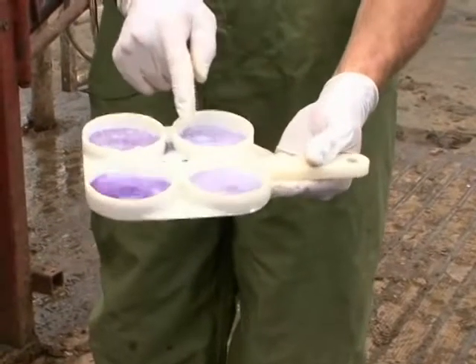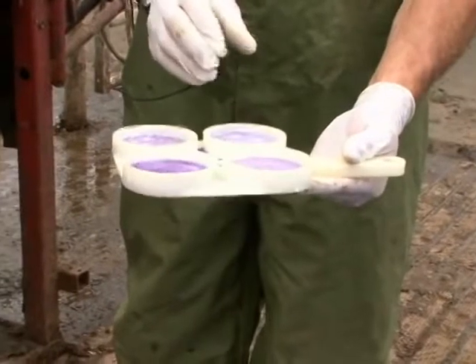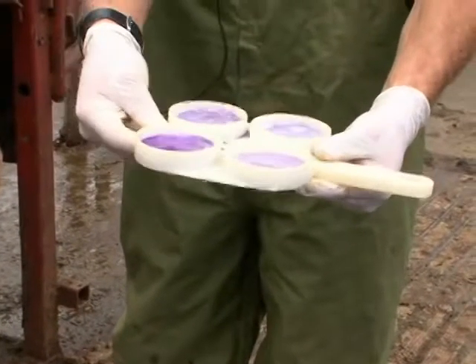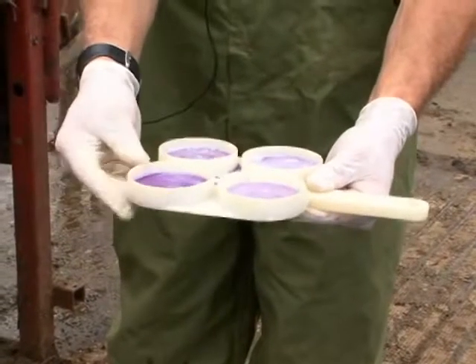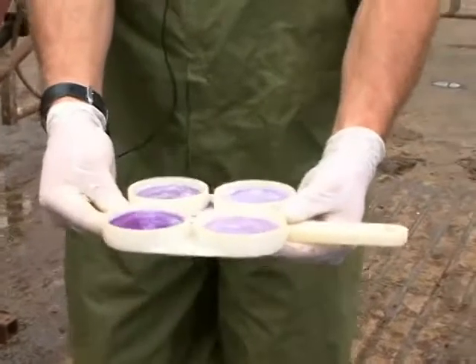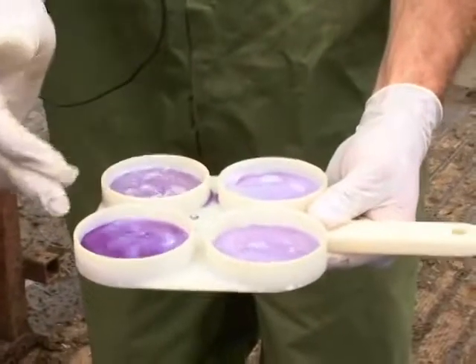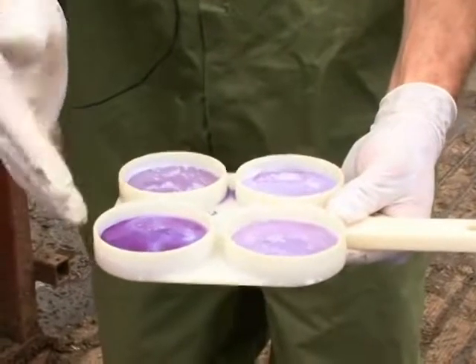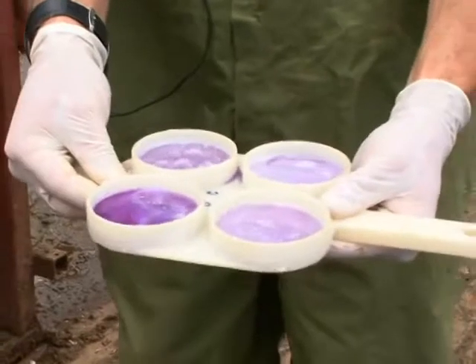And this one is a bit thicker and tends to be a bit more tacky and not so liquidy. But the most striking one in this result is her right hindquarter. You also notice that the color changed differently, again as a pH indicator. So she has a very high level of white blood cells or somatic cells in this well right here.